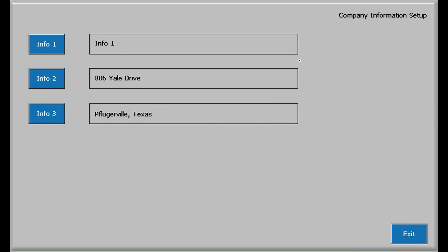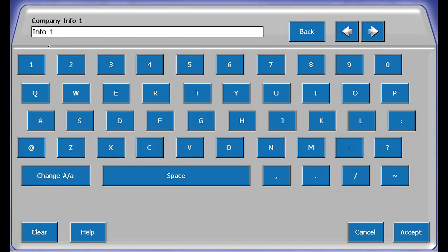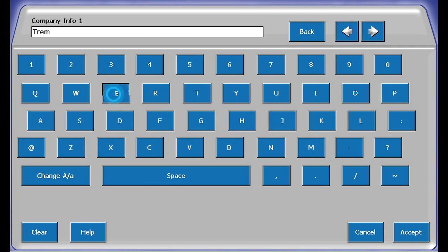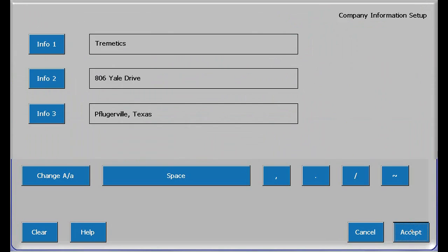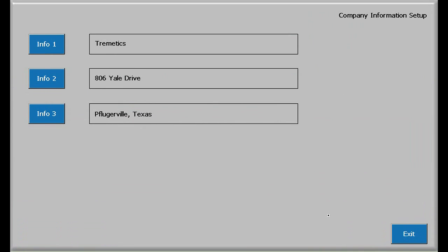Company setup is a breeze after tackling the questions and answers example. Three lines of information are available for printing on the top of each audiogram or printout. Just touch info1, clear, and enter your first line, followed by accept. Repeat for info2 and info3 and exit out of the company setup screen.